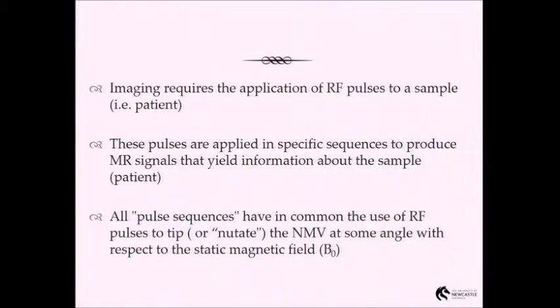If you have a matrix which has 128 phase encoding steps, you have to do 128 phase encodes. That's why, when we run a typical MR sequence, it goes for minutes. Not like a CT where we scan, that's a slice, scan, that's a slice.